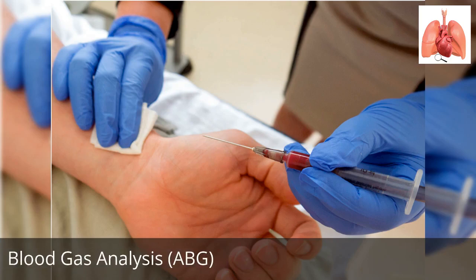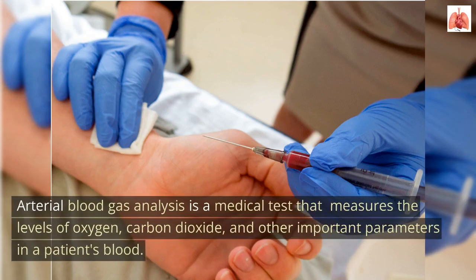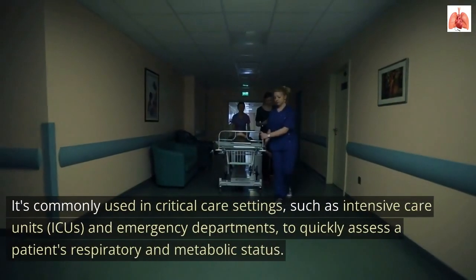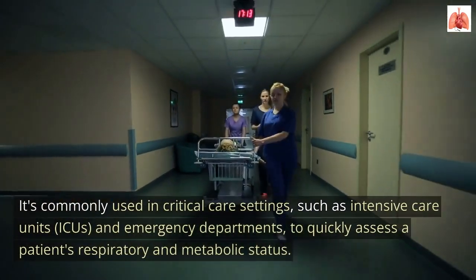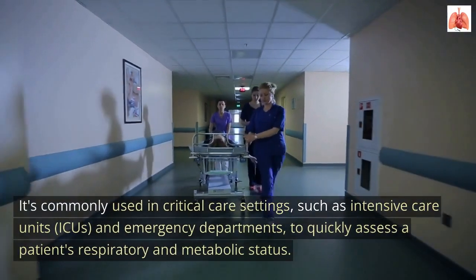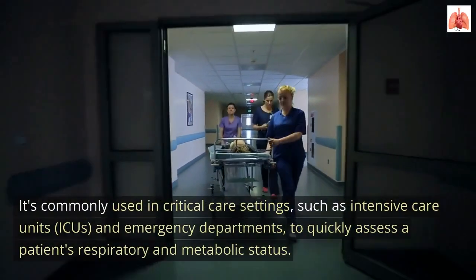Blood gas analysis, ABG. Arterial blood gas analysis is a medical test that measures the levels of oxygen, carbon dioxide, and other important parameters in a patient's blood. It's commonly used in critical care settings, such as intensive care units, ICUs, and emergency departments, to quickly assess a patient's respiratory and metabolic status.